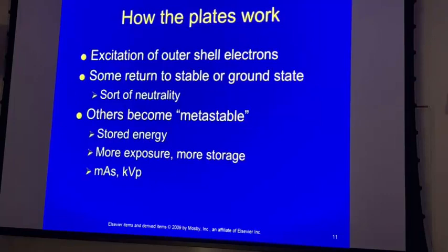And what we get is an excitation of those outer shell electrons. They temporarily leave their shell, they drop back into place, and they glow a little bit, but they also hold on to some of that, and that's what we call metastability.